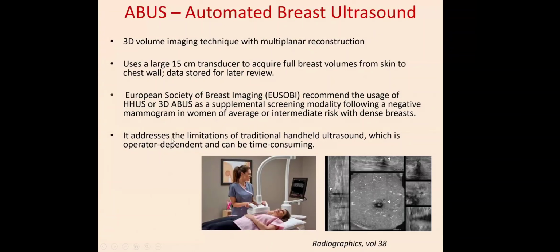Although it's done automatically, during review you have to give more time because you have to see each and every image. It can be done even by a non-radiologist: you just put the transducer and immediately acquire, so your time is saved there. But here you have to give time to see all the sections, like you see CT images.